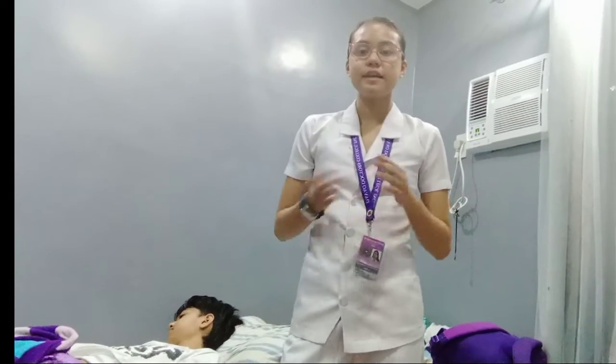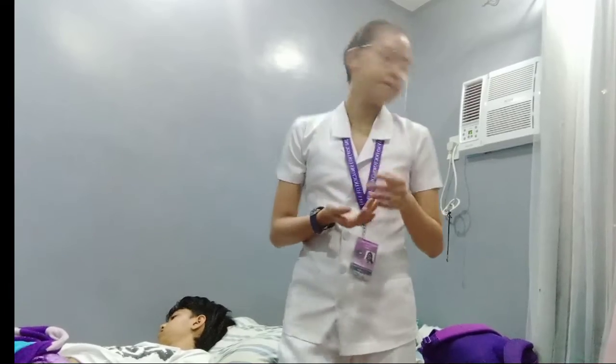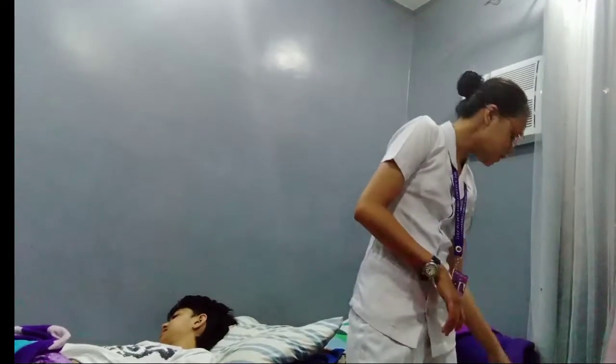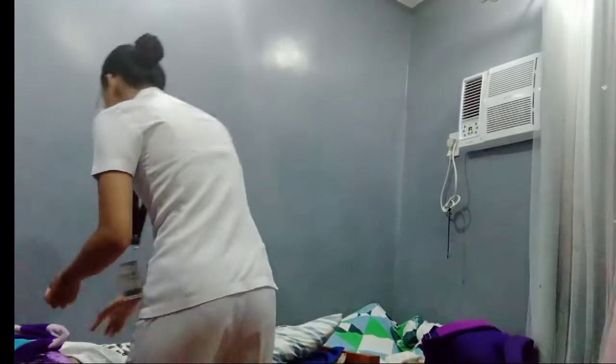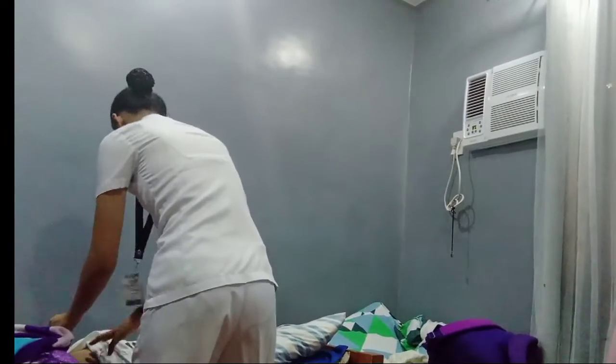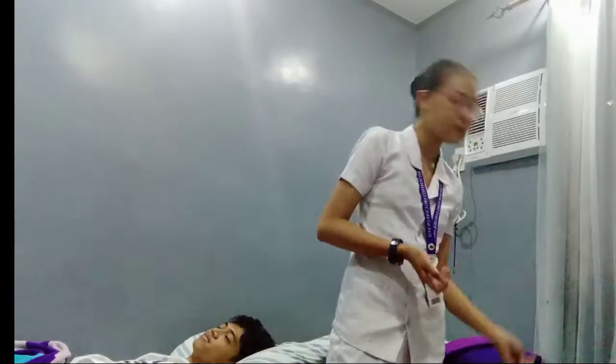Yes. Okay. Next, we need to apply clean gloves and clean the site with an antiseptic swab in a circular motion, starting from the center outward to avoid cross-contamination and bacteria. Okay, so Hazli, I didn't have an antiseptic swab, so I will be using a 70% alcohol cotton ball. I will be cleaning the injection site here in your abdomen, okay? Circular motion. And you need to throw this in the receptacle bin.